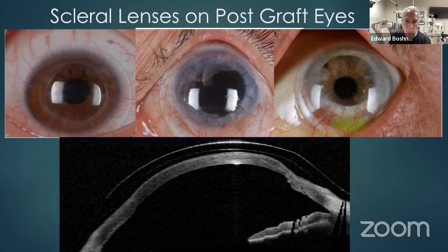And again, very often I've noticed that when you're dealing with a transplanted cornea, you're going to see a tilt. Look at the outline of the OCT image below. Notice how there's a tilt in there. And you fit this eye with a regular scleral lens, and maybe it touches one area or rubs against one part of the cornea, and you have clearance in another part. Well, I don't want rubbing on a donor cornea because I don't want to take a chance on any rejection.